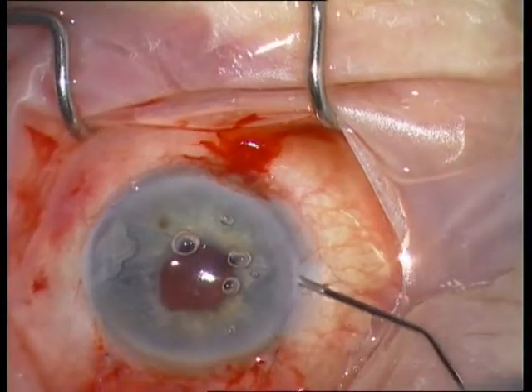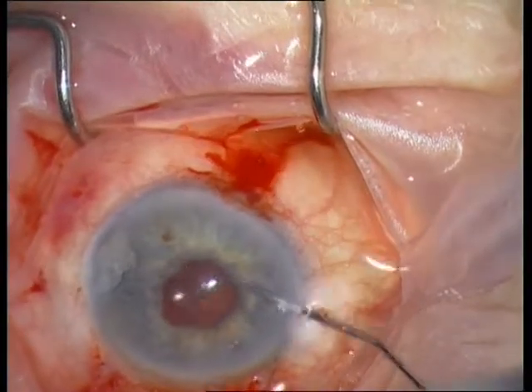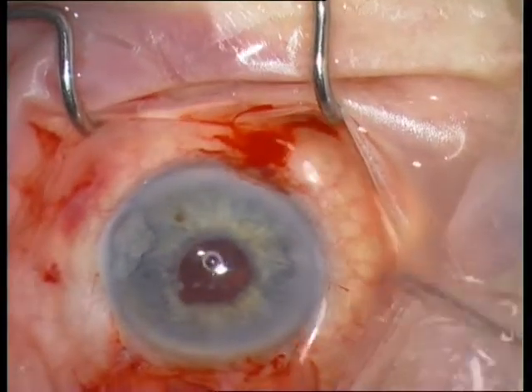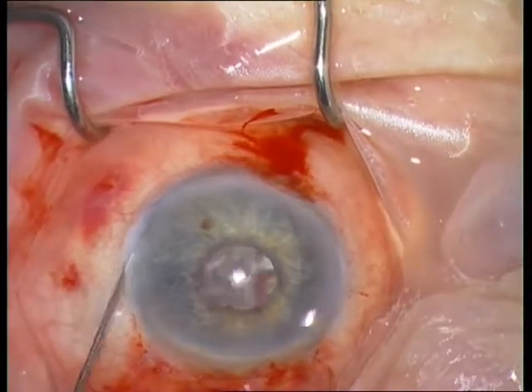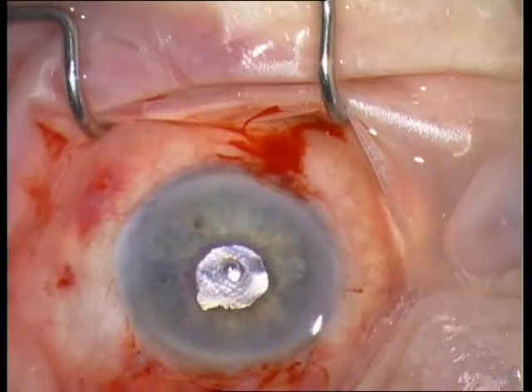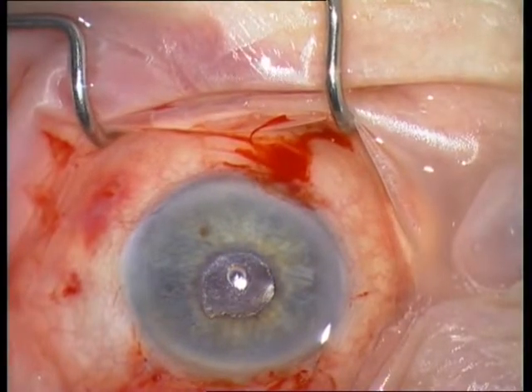Finally, inject BSS in order to remove the viscoelastics.